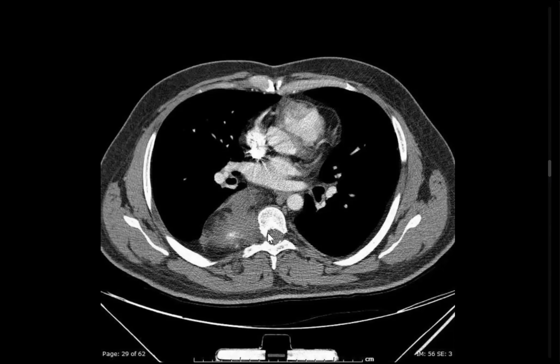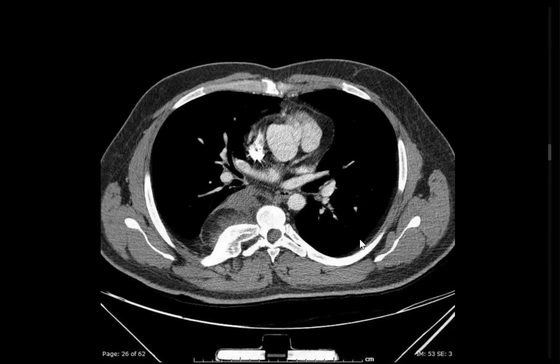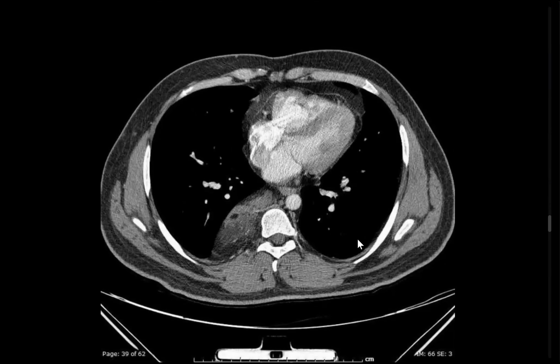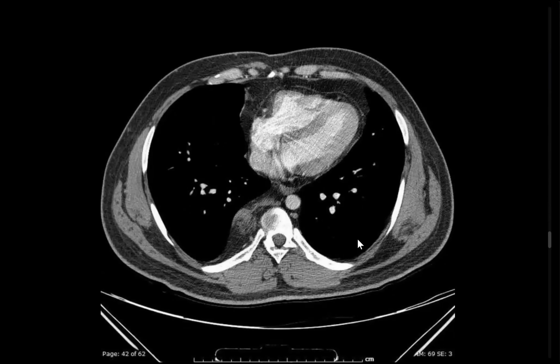Okay, very good. Except one point. Did you see the lower cuts? Okay, sir, no, I forgot. It's normal, but in the exam, please go to the last cut. Don't forget this point. Okay, I'll give you another case.